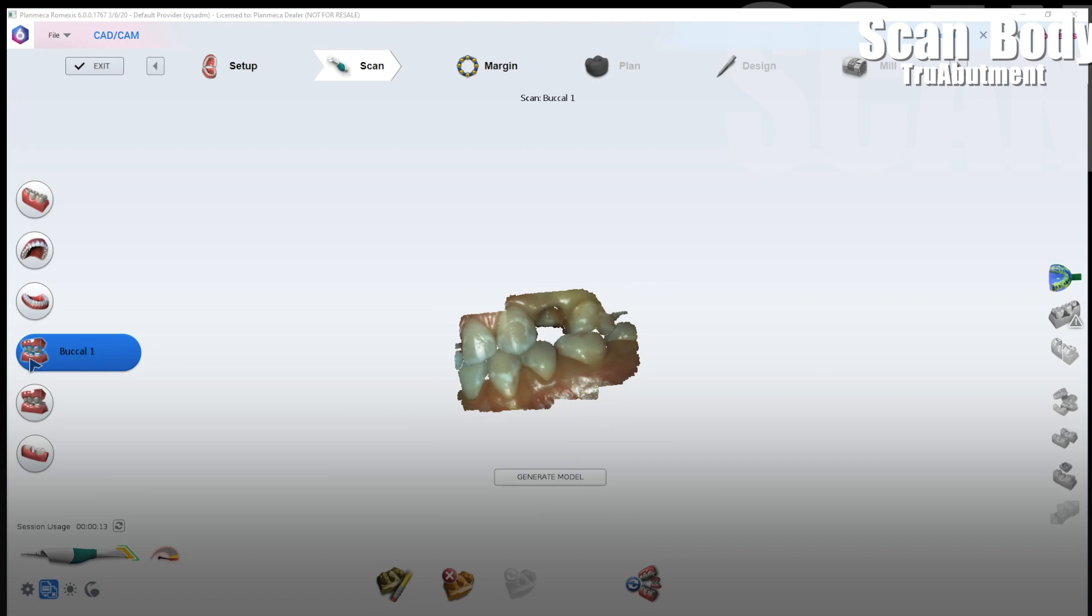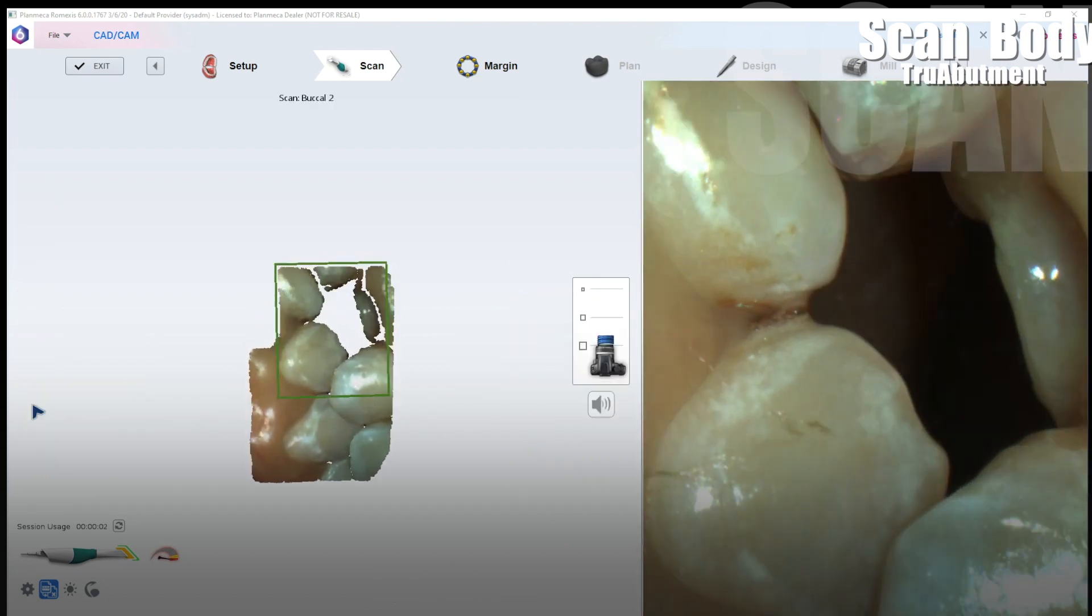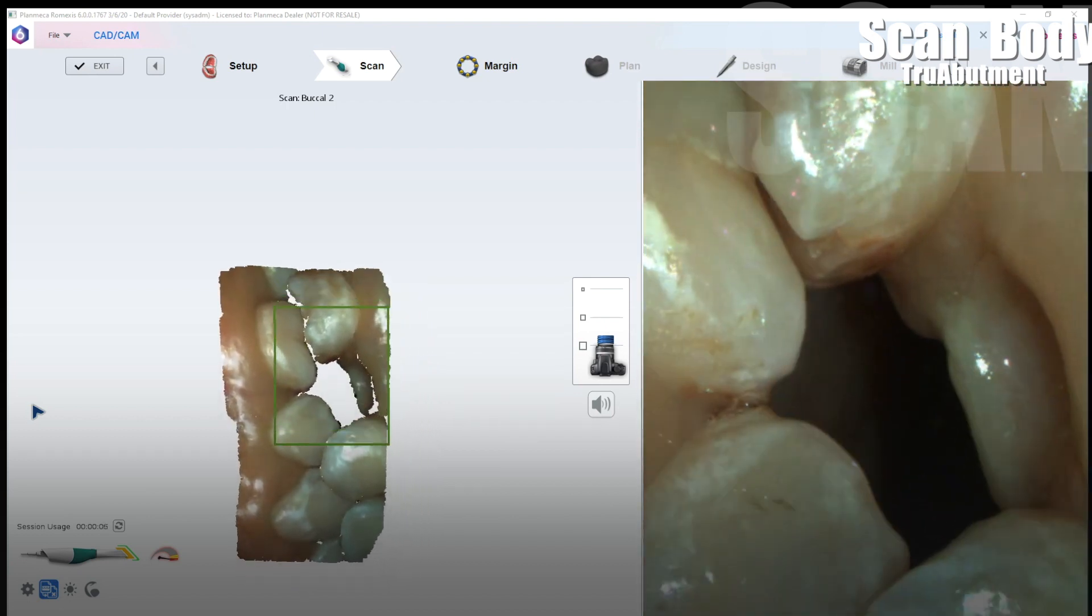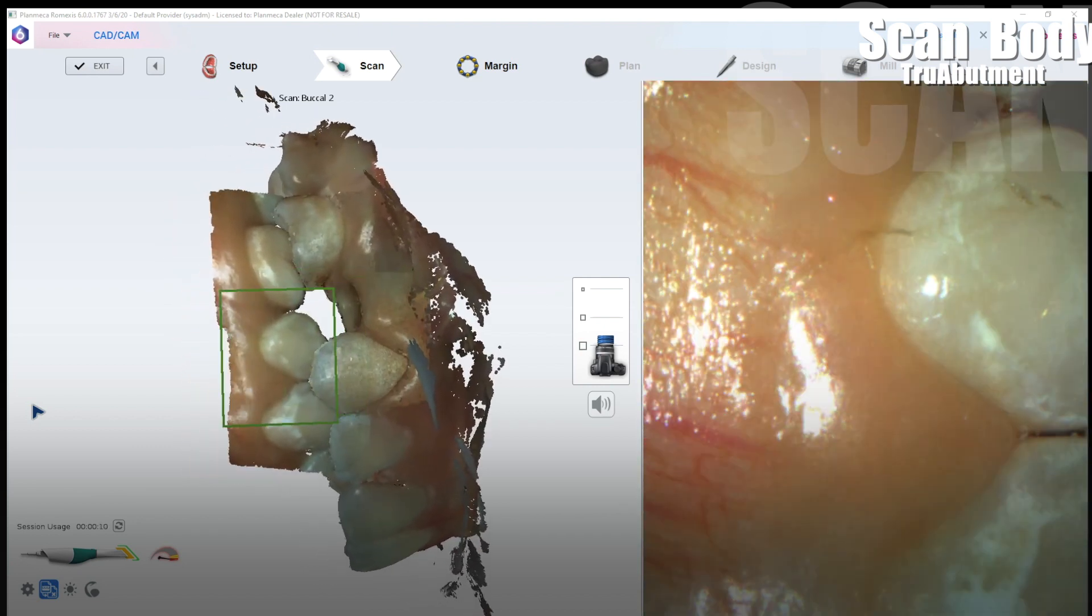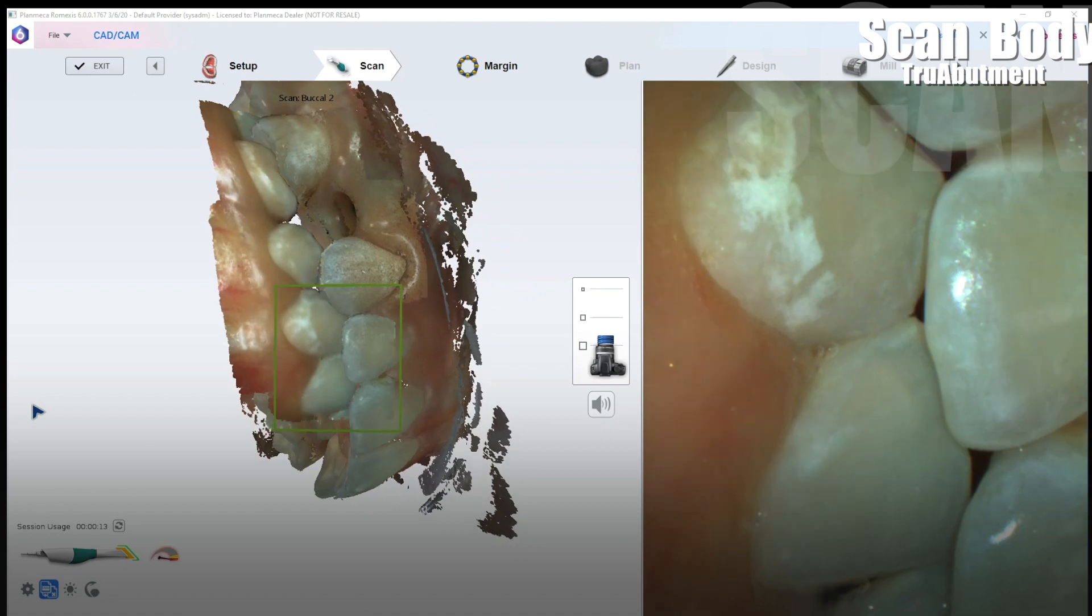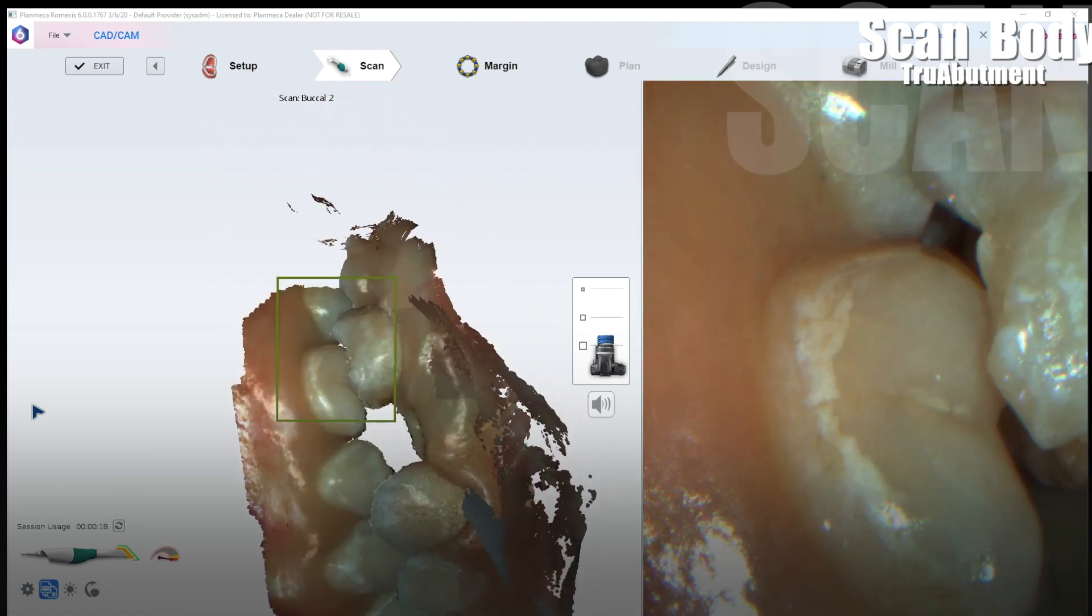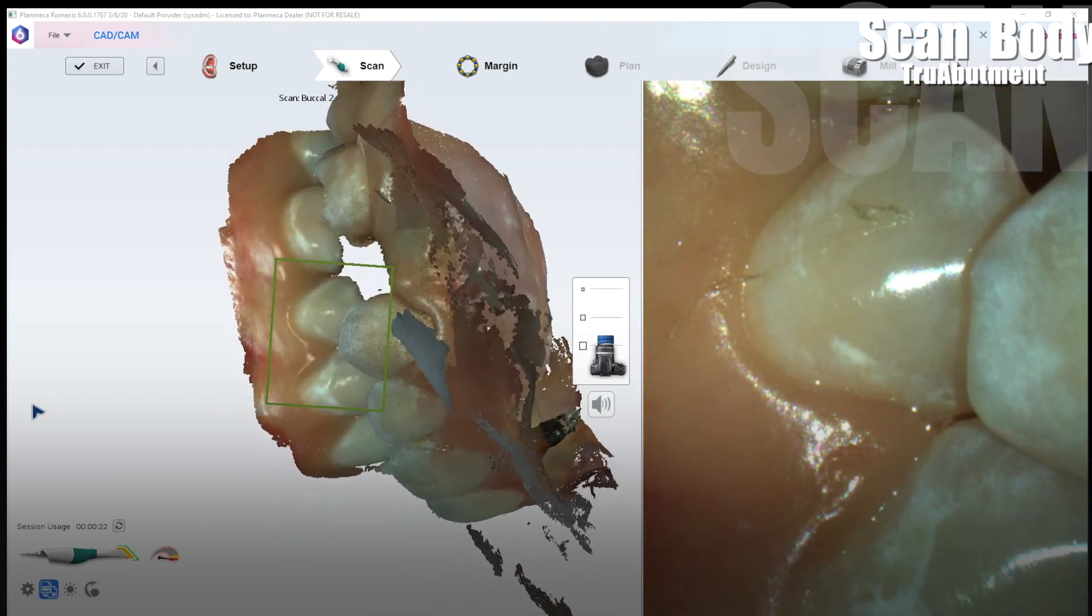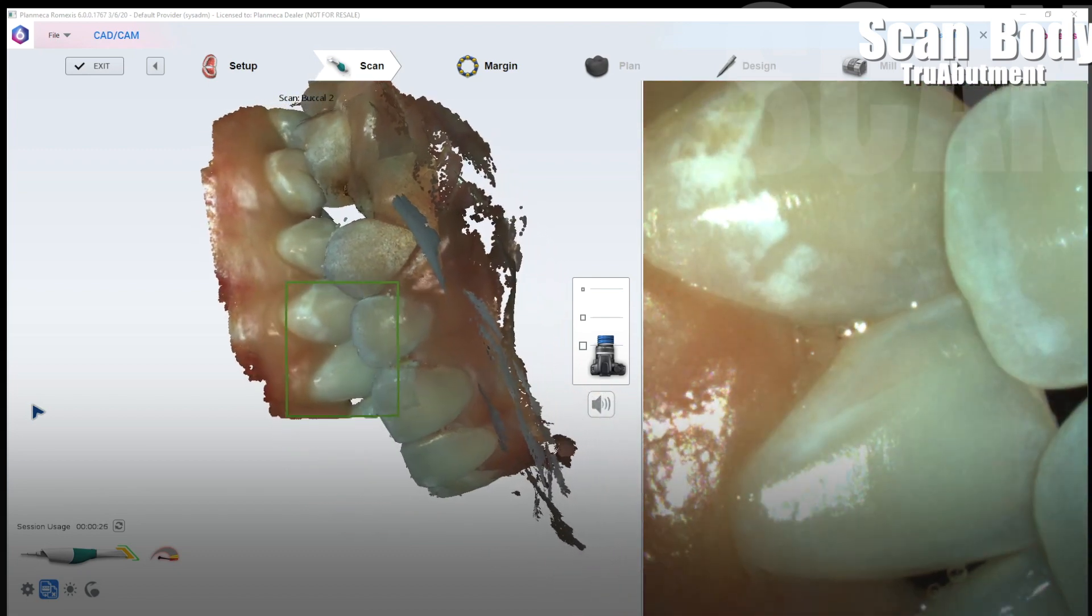I struggle sometimes with bilateral bites. Oftentimes I'm very easily able to get the first bite to ghost in. But on the second bite I typically find that one or two of the arches do not ghost in and merge with the second bite scan. It's not a big deal. Sometimes I'll go ahead and try to play with it a little bit. But other times I'll just stop like in this instance and I'm going to go ahead and manually pin that one bite.